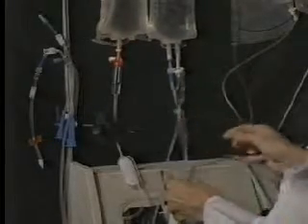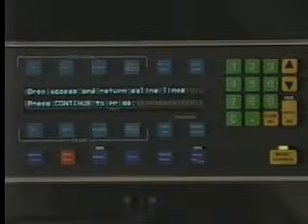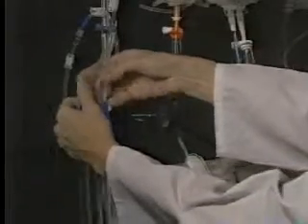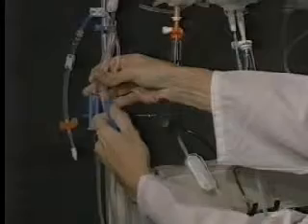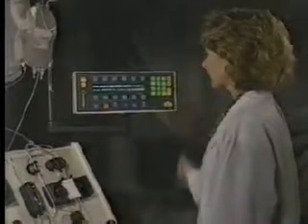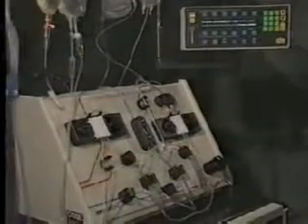Press the continue key. The system then instructs you to open the access and return saline lines. After opening the access and return saline roller clamps, press the continue key to prime the tubing set. The system performs several tests as part of priming the tubing set.